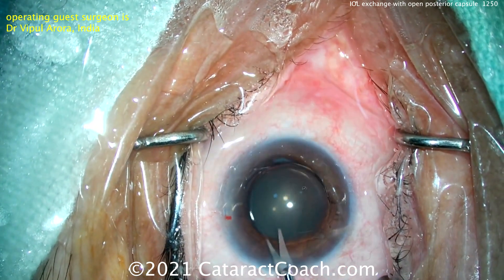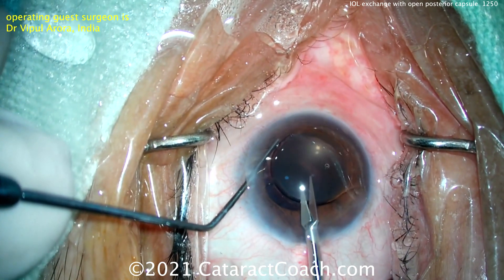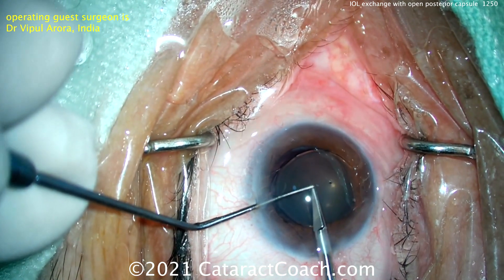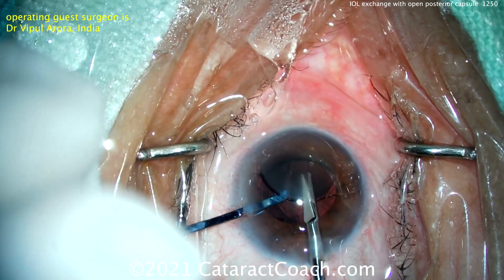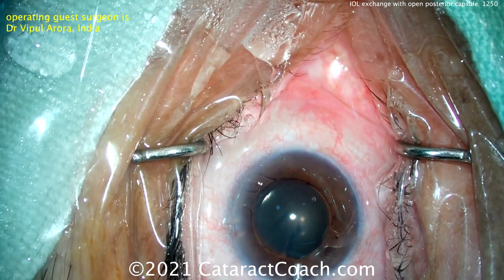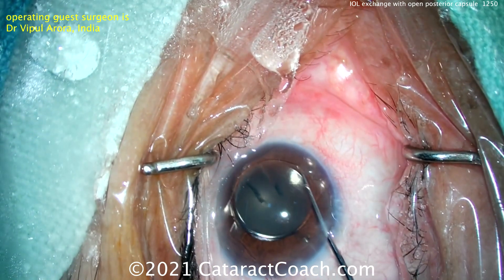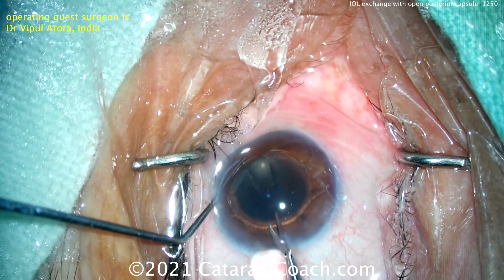Let's see what's being done here — scissors. Dr. Arora, scissors are a good choice, I approve. But I do like my twist-and-out technique better. Cut the lens down the middle. I like how the left hand is using that chopper or hook to stabilize the lens so it doesn't fall away from the scissor tips — otherwise it tends to run away from you. Another cut — that's a lot of cutting. Be careful of that corneal endothelium. Good — more viscoelastic. The lens is being rotated and cut. It looks like the lens will be trisected into three pieces, which should make it very easy to remove. You could remove this lens using the twist-and-out technique through an unenlarged incision.